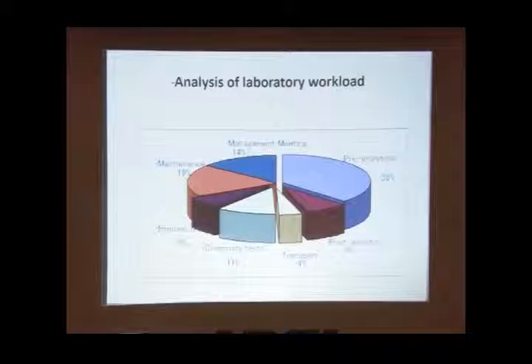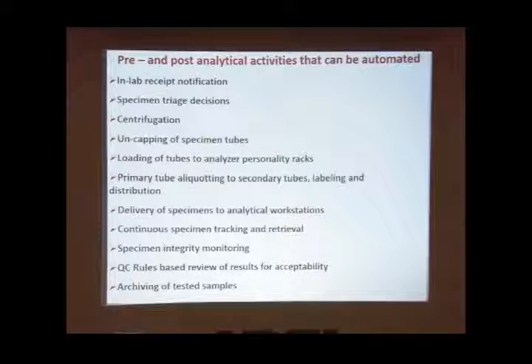So from this, you can see that the pre-analytical phase takes a lot of our time. Now, what are all the activities which could be automated?